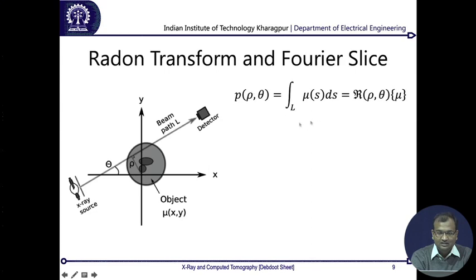That thing is also called the Radon transform, according to the classical notations of projection geometries. What the Radon transform does is integrate all values which come along a particular line. It's just a whole line integral. Since this line is defined by rho and theta, rho is the distance from the origin of the coordinate system to my line, and theta is the orientation of my line. If I draw another line, say this one, that is also at a distance rho, but my theta is different for that particular line. Or say I have a line cast parallel to this line, I have a different rho but the same value of theta, and there will be different entries over there.